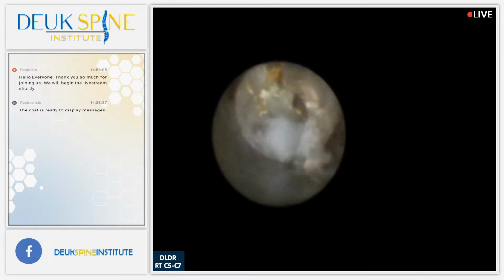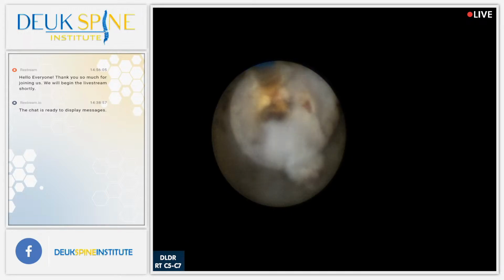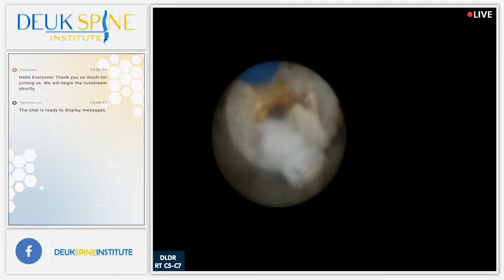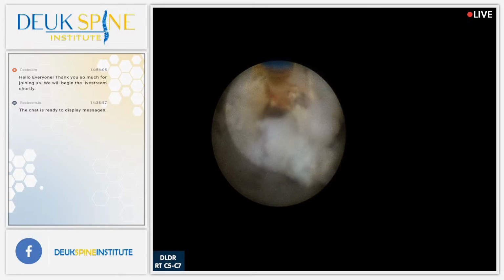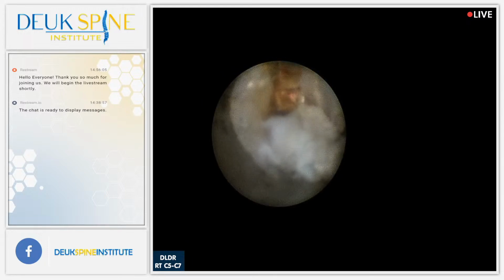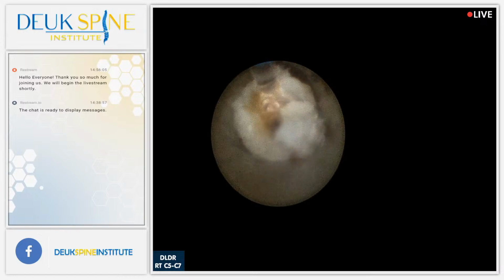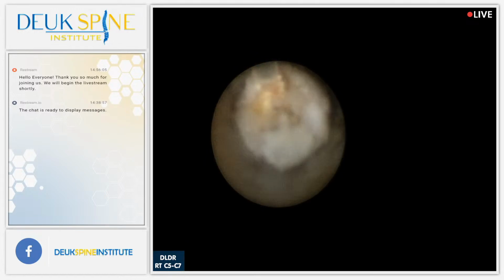Yeah. He's had this for a long time. He has a job with a lot of rotations. Being a football player at a professional level, I guess they do. Well, it's still college pro, pretty close. Don't want to take away from the pros, but yeah, he's got some pretty bad spurs back here. Look at that. Very interesting. He's definitely taken a beating as a professional athlete or a semi-pro athlete with his neck.